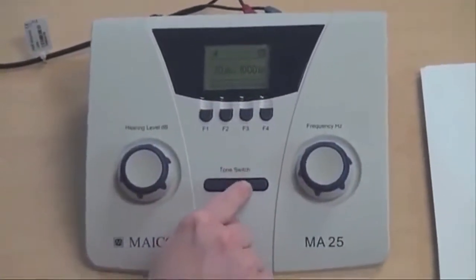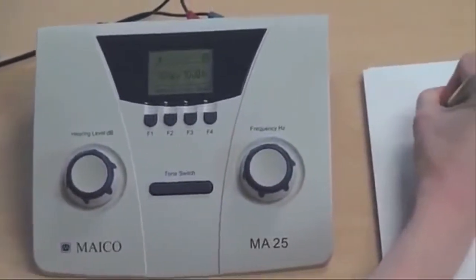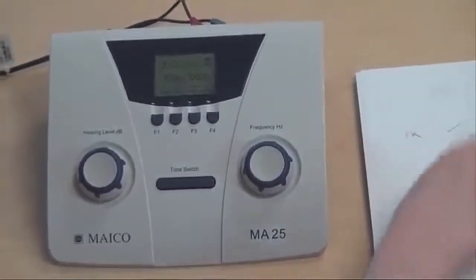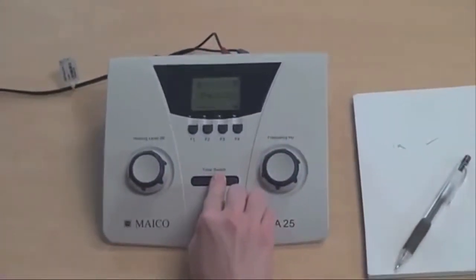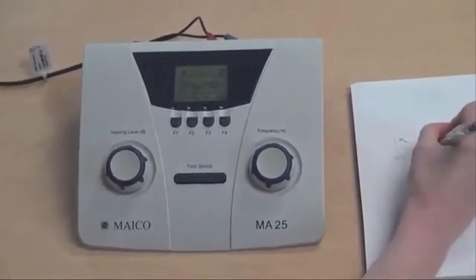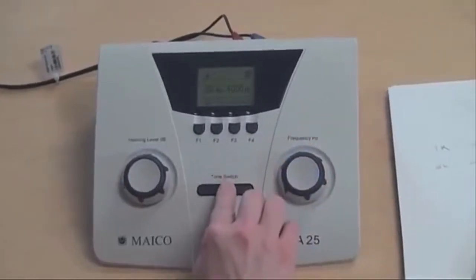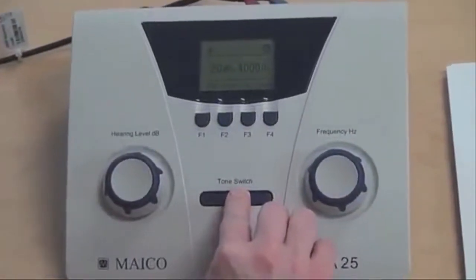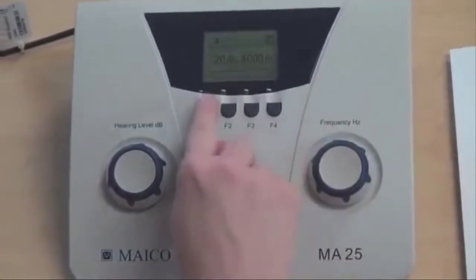After the practice tones, turn the level dial down to 20 dB and play the 1000 Hz tone. Record if the child responds. Play the tone again to confirm that the child responds. Next, change the frequency dial to 2000 Hz and play the tone as before. Record the results. Repeat the same procedure at 4000 Hz. Switch to the left ear.